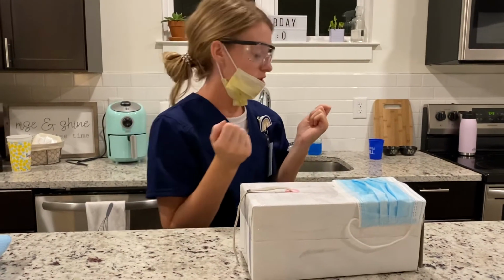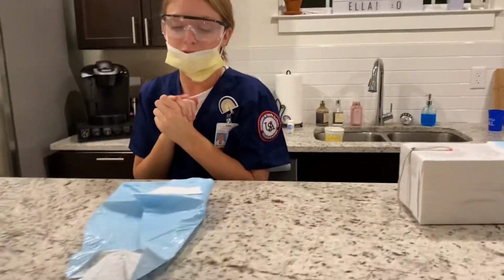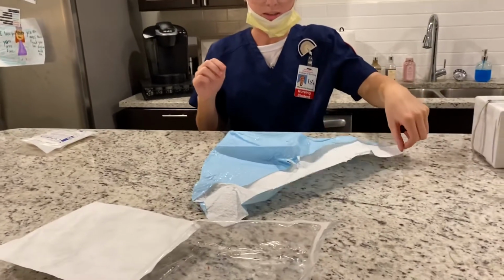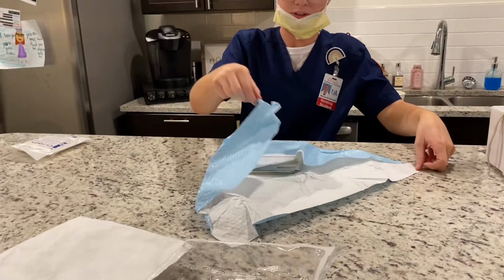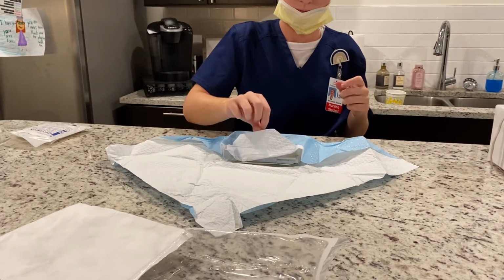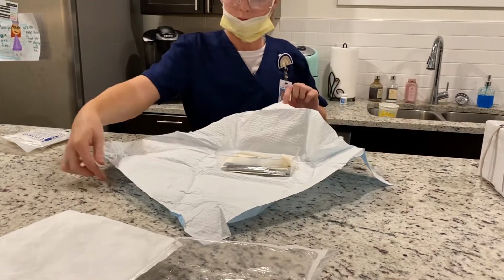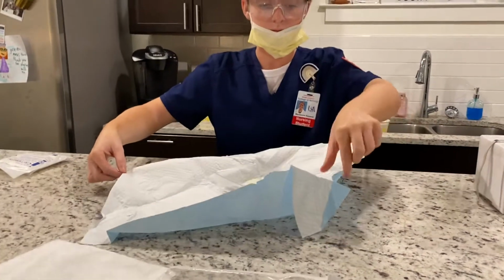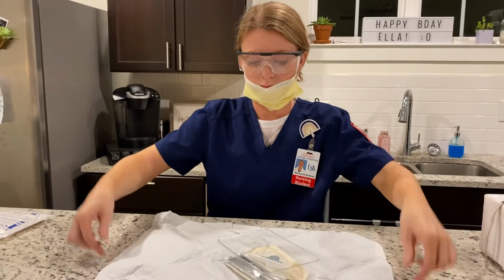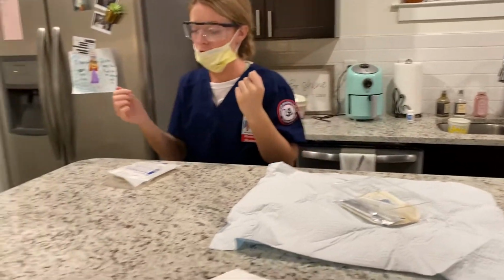So now I'm going to perform hand hygiene, and I am going to open up the kit using aseptic technique and only touching the 1-inch borders. So now I'm ready to put on my sterile gloves.